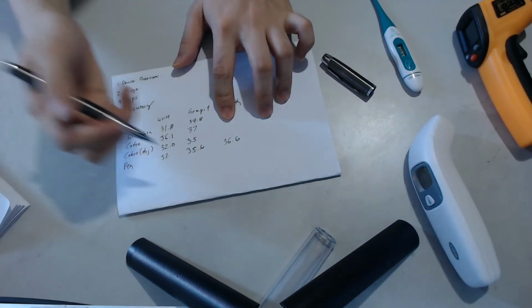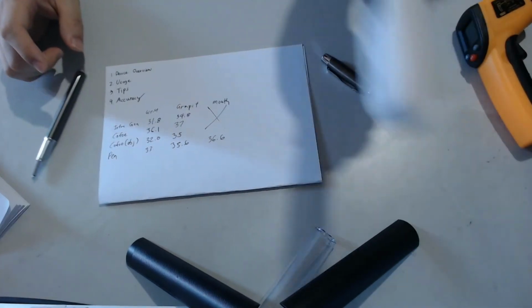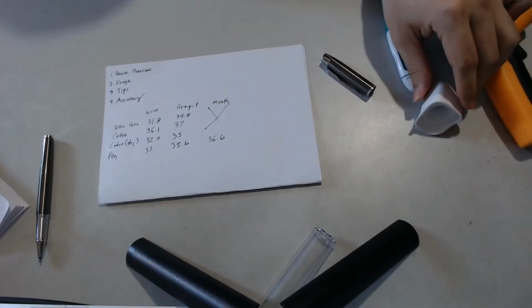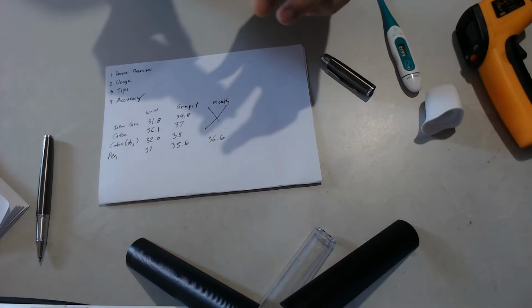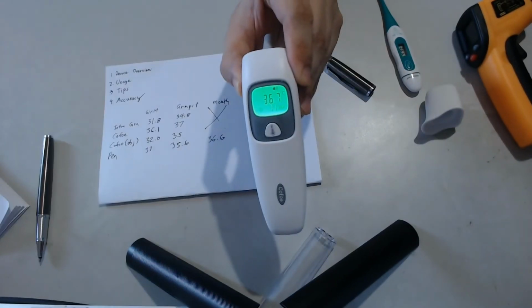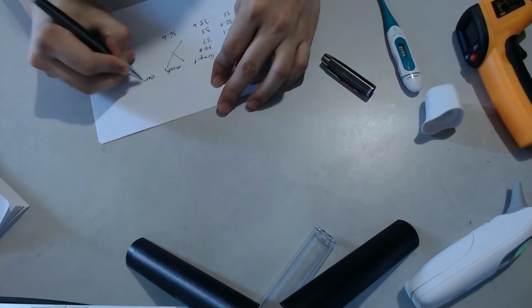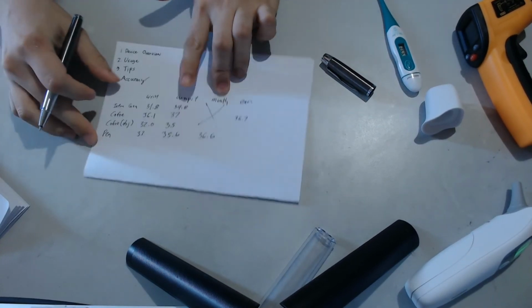This is a classical thermometer. So this one, I'll ignore this. However, what I'll do is I'll take the temperature of my ear. 36.7. There.